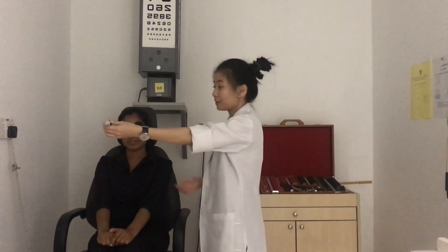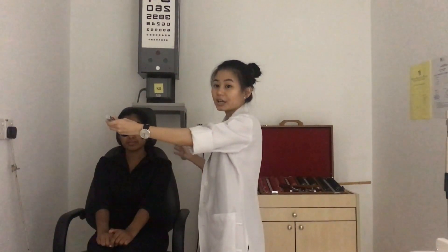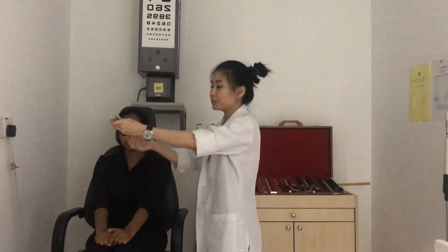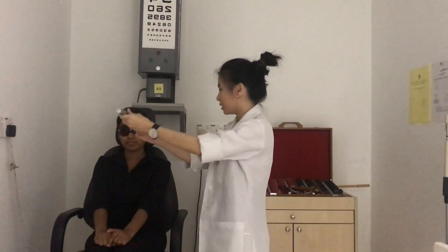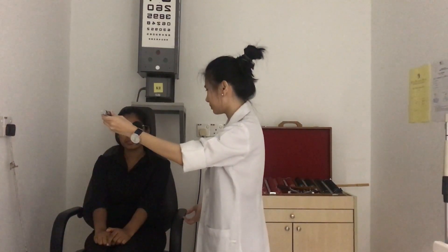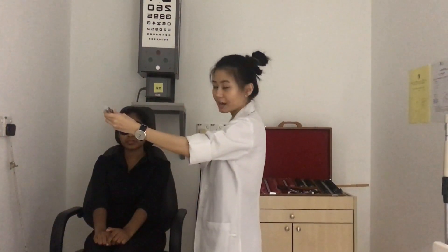For this test we use the Worth 4 Dot flashlight, which is the same as the near Worth 4 Dot task. Place the flashlight at a distance of 40 centimetres in front of the patient's eyes. Ask the patient to inform you if they see a different number of dots as you move the flashlight away from them. Record the distance at which the patient reports seeing a different number of dots.